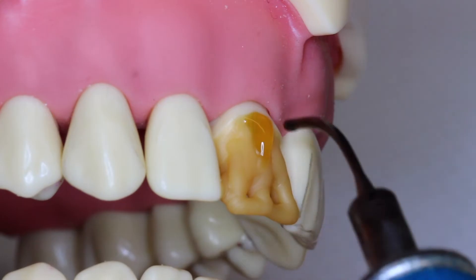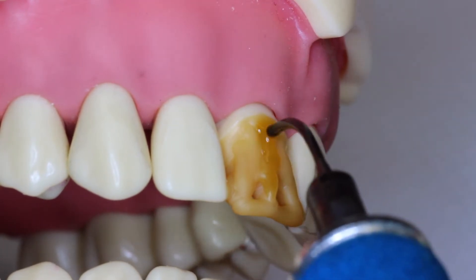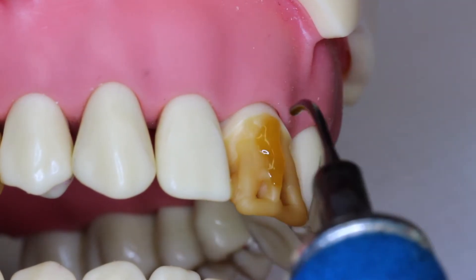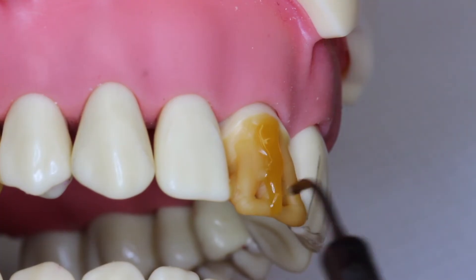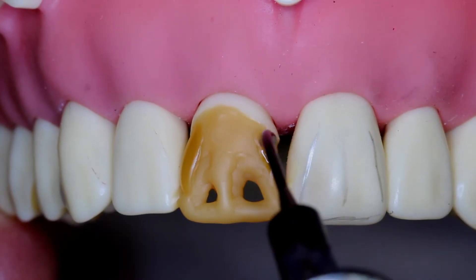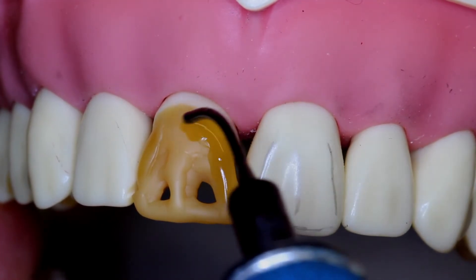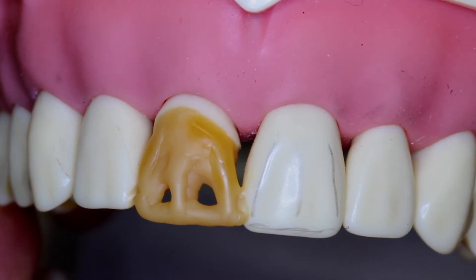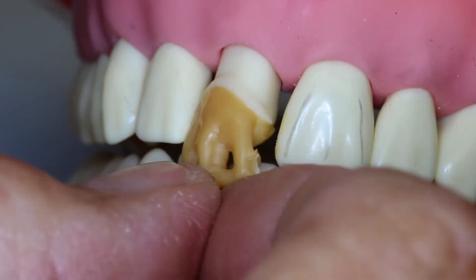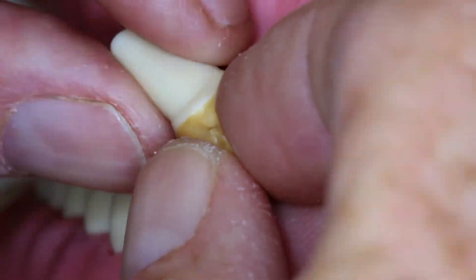This angle also starts to show you the inclination of the height of contour. I need to add more at the cervical area, and from this viewpoint it looks like the incisal edge is facially oriented. Developing line angles to shape to the tooth next to it will make it look more like a mirror image of that tooth, which is a very important aspect of aesthetics in the central. Taking the tooth out of the typodont, we can begin to develop the proximal area and proximal contact.